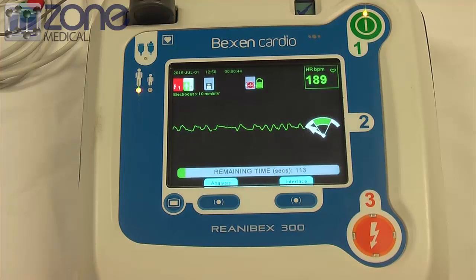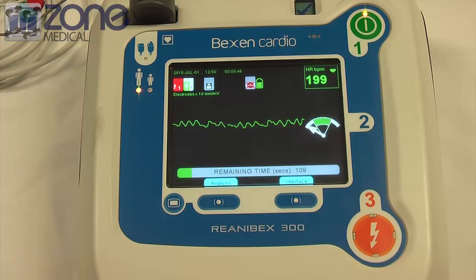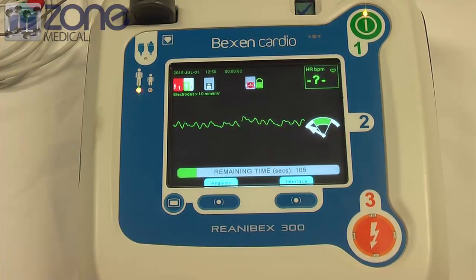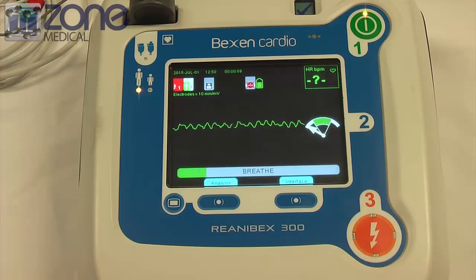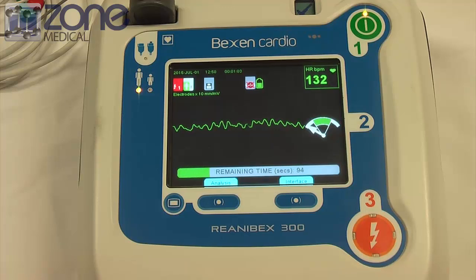Keep timing the beat. Keep timing the beat. Stop compressions. Breathe. Breathe. Continue with compressions.